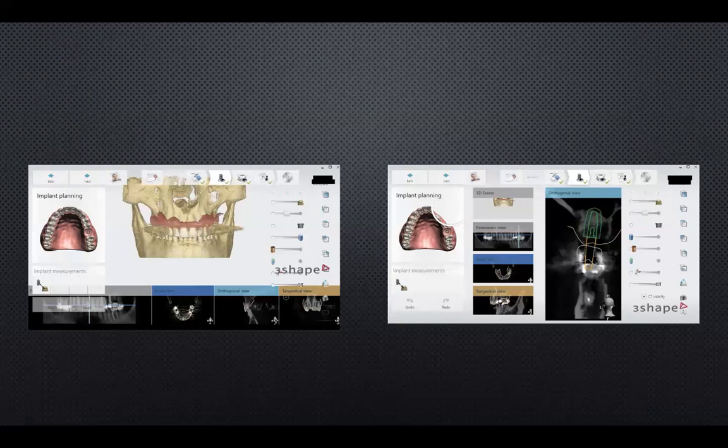If you don't have it, you have to plan for bone grafting and other procedures. I'm not going to go over the details of implant planning and its requirements individually, as we all know about it, but you can play with the implant position until you are satisfied with it.